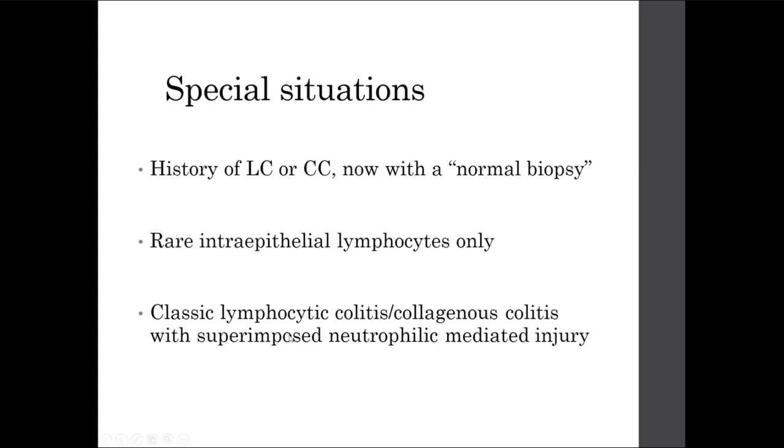And lastly, those cases that are actually classic for lymphocytic or collagenous colitis, but now they show up with these features in addition to neutrophilic mediated injury. So neutrophilic mediated injury, we said cryptabscesses or cryptitis, are not very typical of this disease.